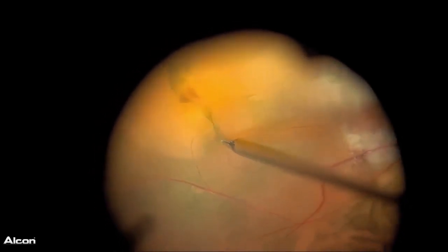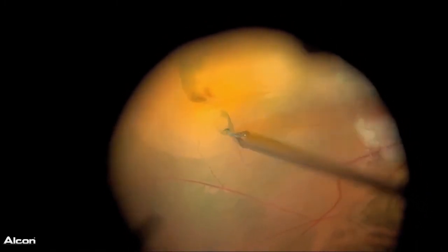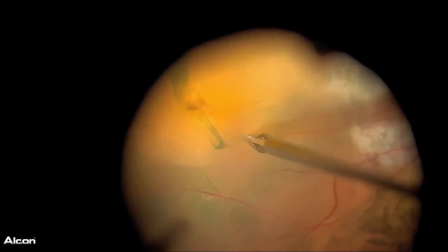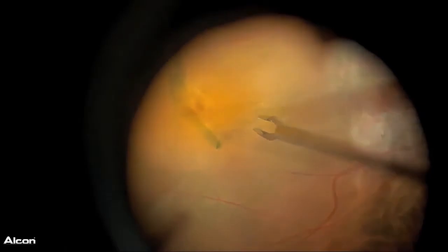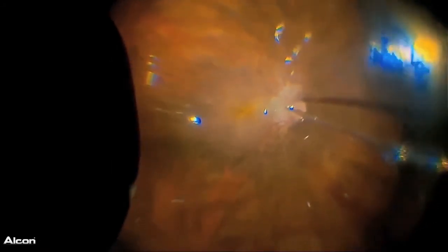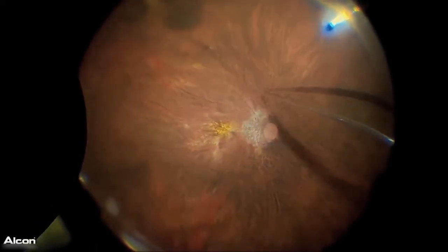After removal of this membrane, I routinely remove the internal limiting membrane stained with ICG with 25 gauge vitreous forceps. It's much easier to perform ILM removal with the 25 gauge vitreous forceps and the Ingenuity system. And then the ILM flap is put inside the macular hole to close it. And it's very interesting that we have a good image during the fluid gas exchange.